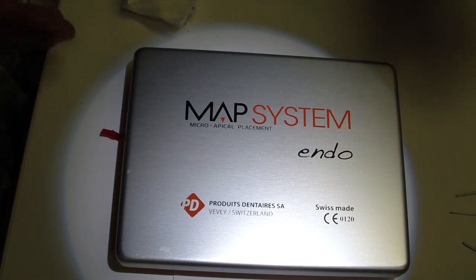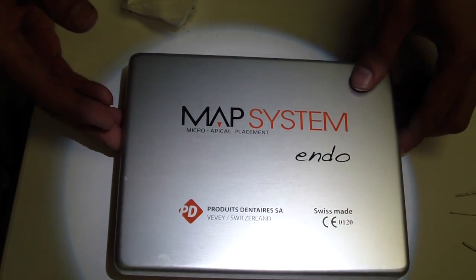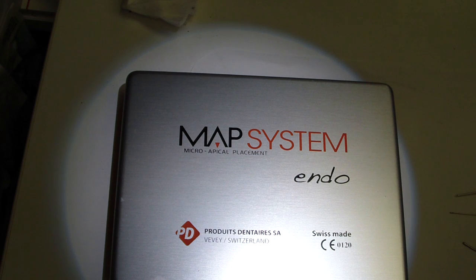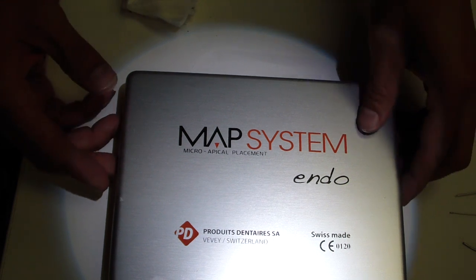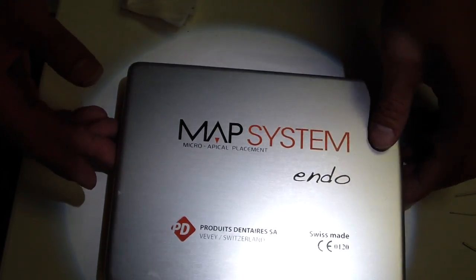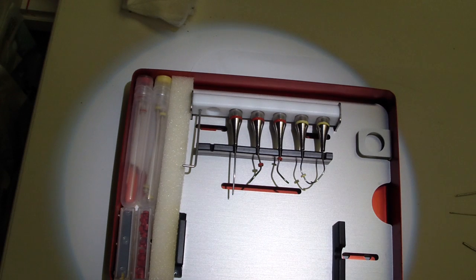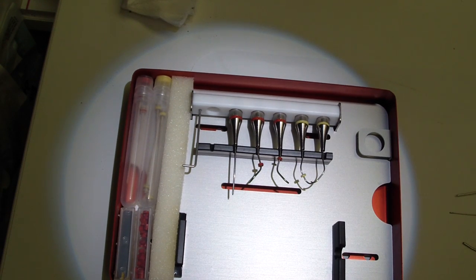The MAP system, micro-apical placement system. I placed MTA a number of times without this and I knew that this existed, but it was very difficult. This was made in Switzerland, and essentially it's a micro-amalgam carrier.